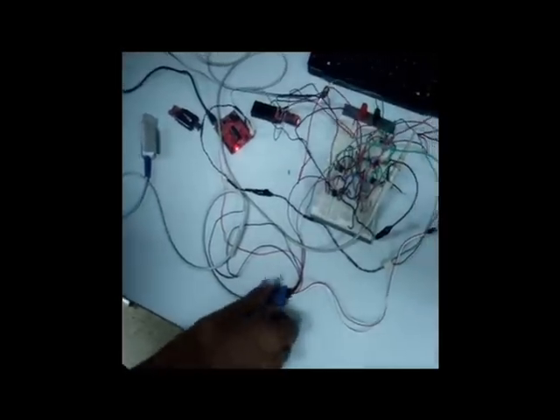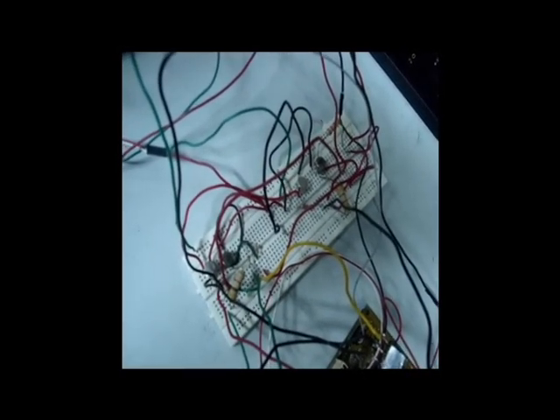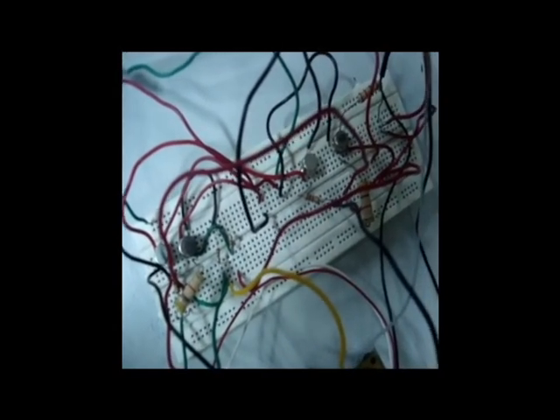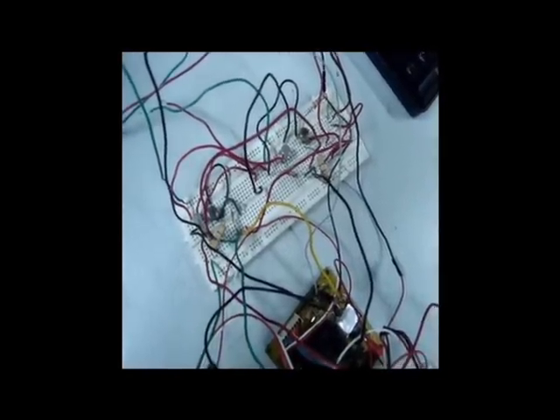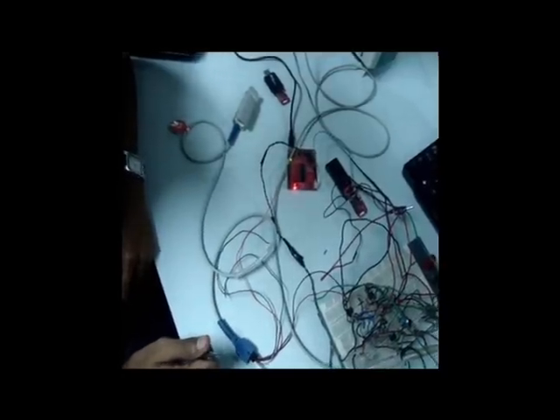The LEDs in the probe are driven by an H-bridge based LED driver circuit. We have used BJT transistors to implement this circuit. The current flowing through the LEDs is of the order of a few tens of milliamperes. Also, the intensity of the LEDs in the probe is controlled by the DAC output of the microcontroller pin. The range of operation of the DAC is from 0.7 to 1 volt. The output of the photodiode is of the order of a few microamperes.